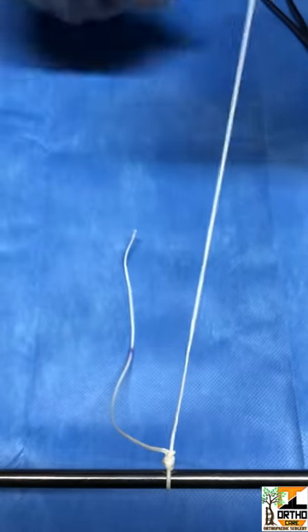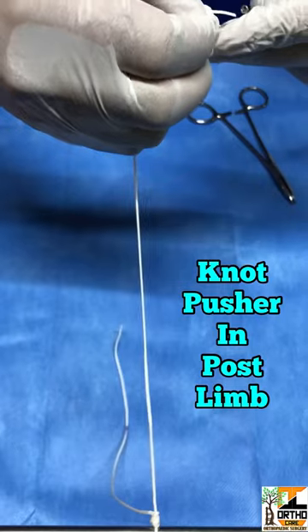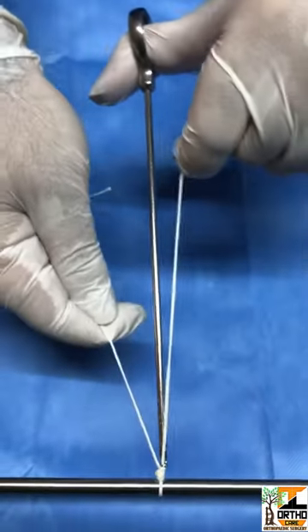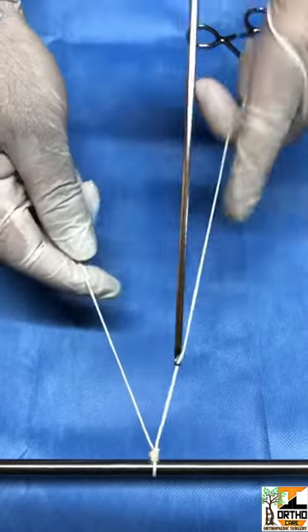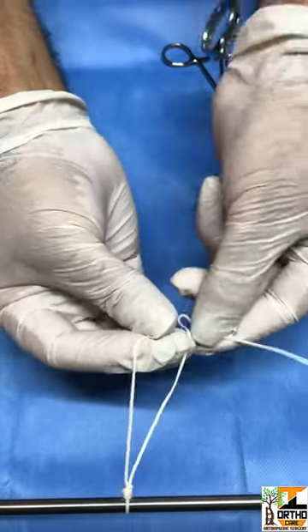You can also push the knot with the knot pusher to make it very tight and adherent to the tissue. You can secure the knot by putting alternate half hitches.